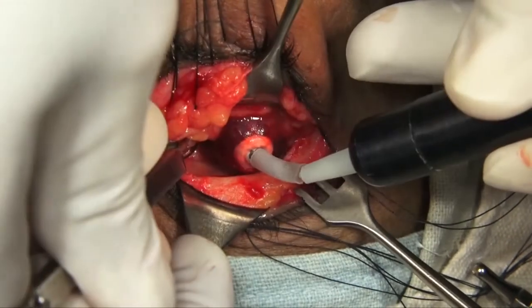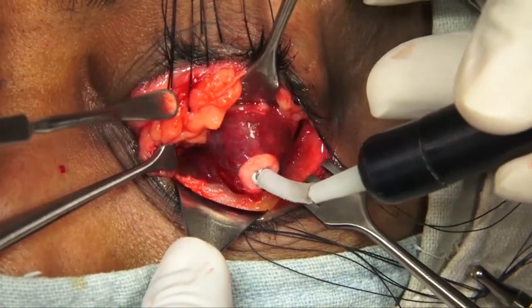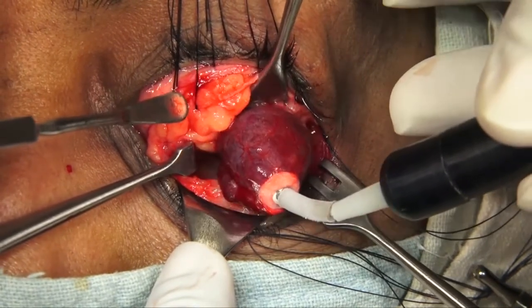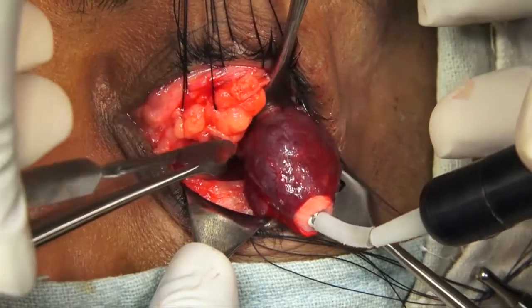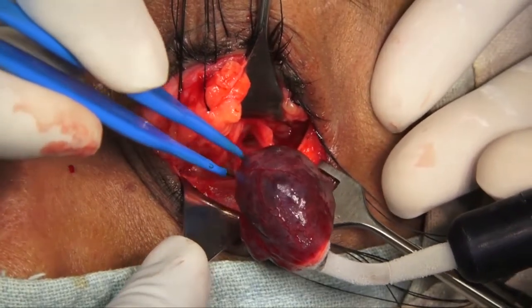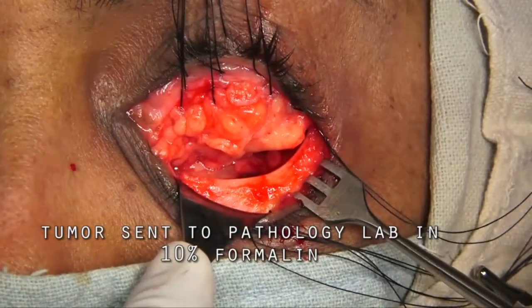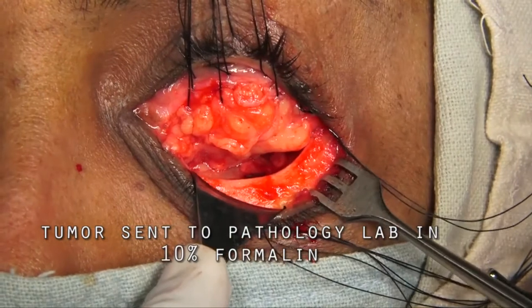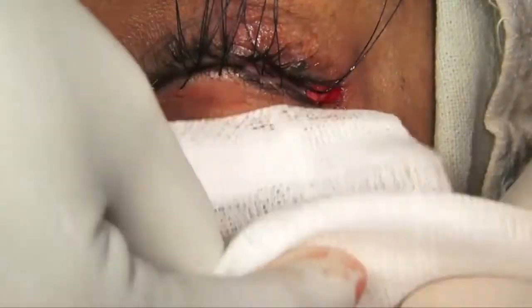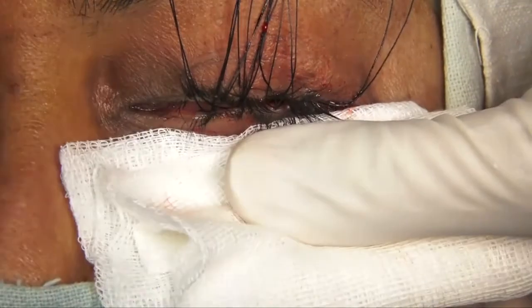Tissue adherent to the tumour is generally separated under direct visualisation. As the tumour is delivered, an attempt is made to identify any vasculopedicle, and if visualised, it is cauterised. Once the tumour is delivered, hemostasis is achieved by pressure and limited cautery.